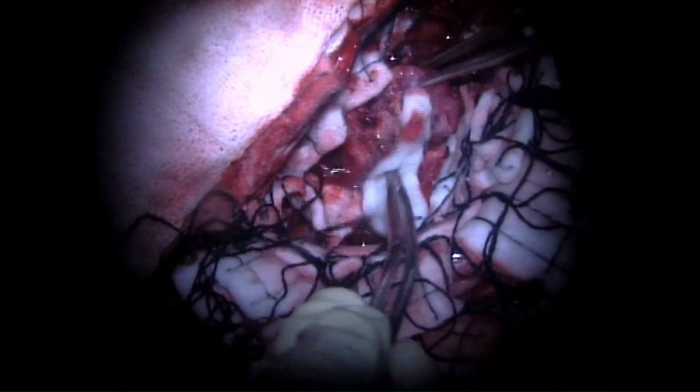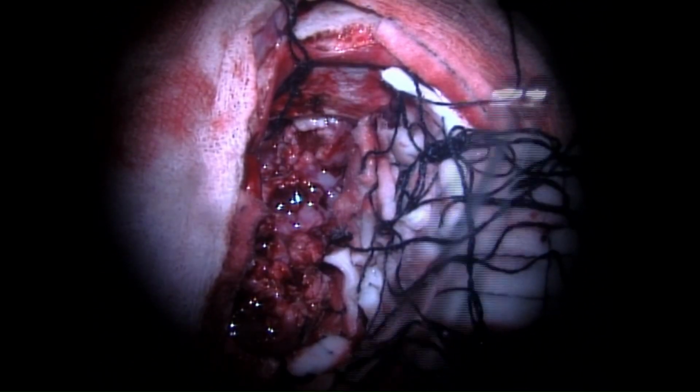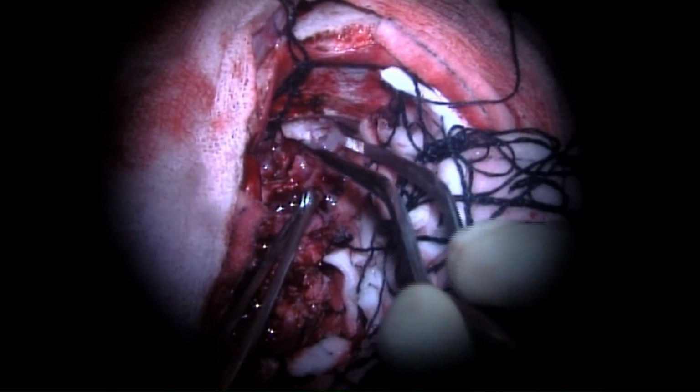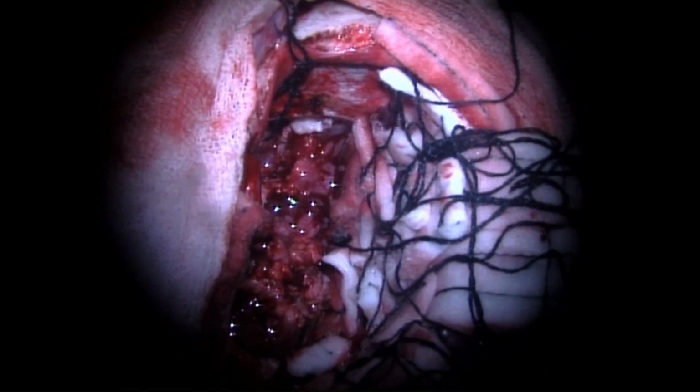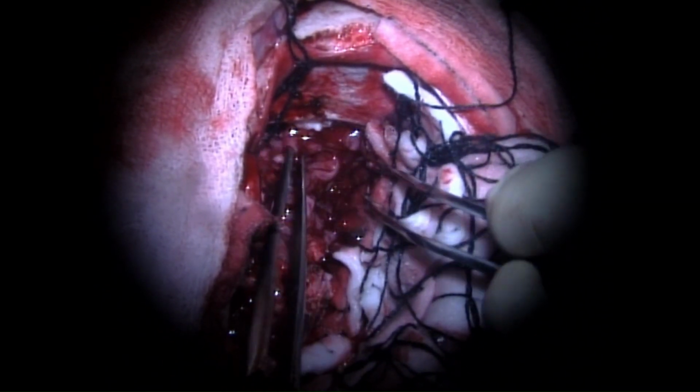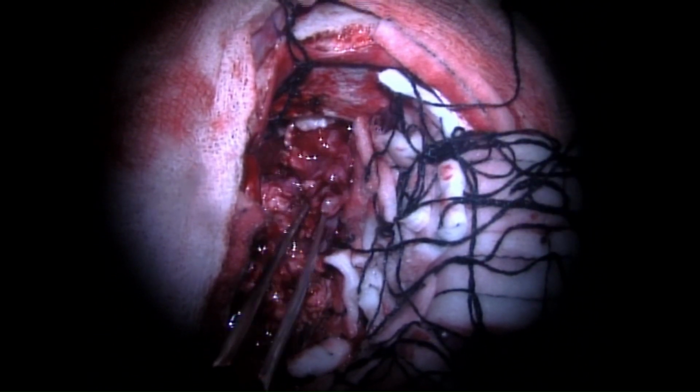Very good illustration of the plane between the tumor and the brain, where more tumor is delivered and it just kept on coming from underneath the falx cerebri.